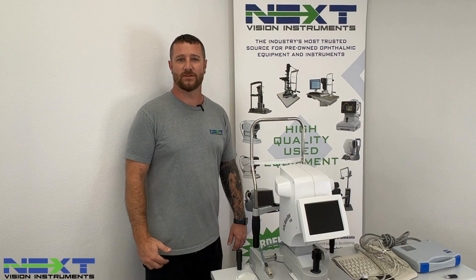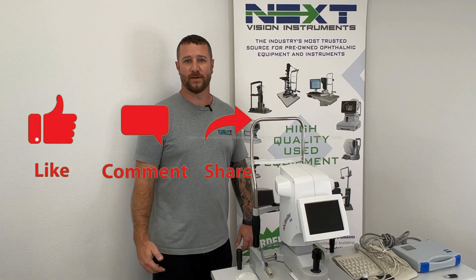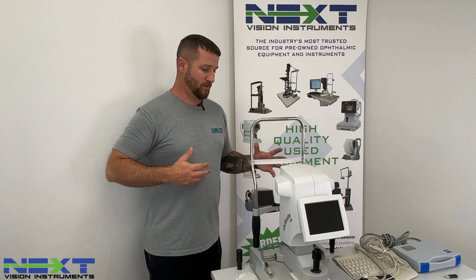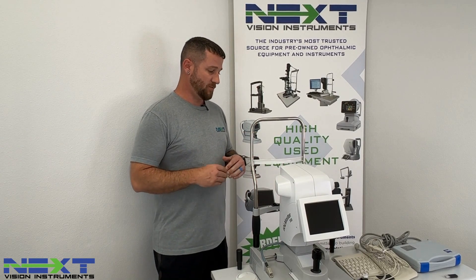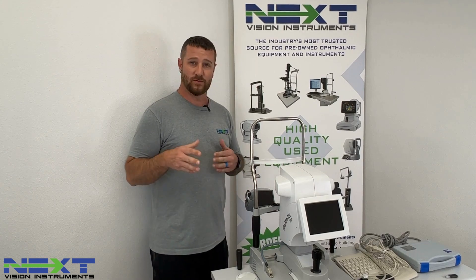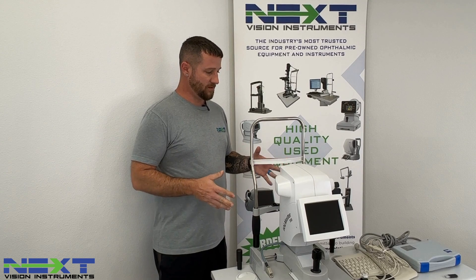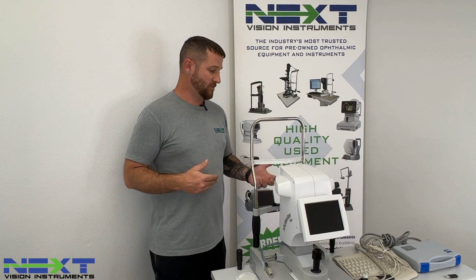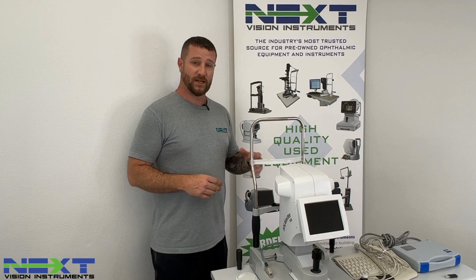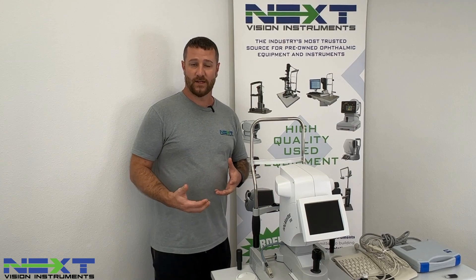Chad French here with NexVision Instruments, the industry's most trusted source for pre-owned ophthalmic equipment. Today we're going to be overviewing the IOL Master 500 as if we shipped it from here to your location. Everything you see here is how you will receive the instrument, and next we'll go through how to connect all the cables, get everything set up, as well as operator training.